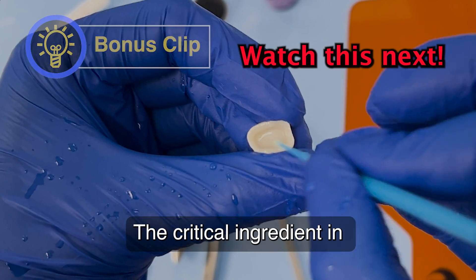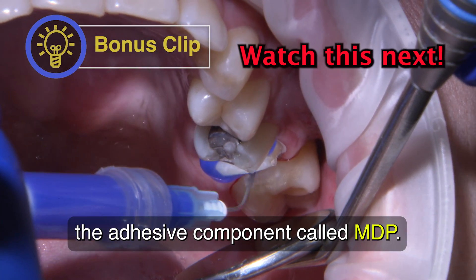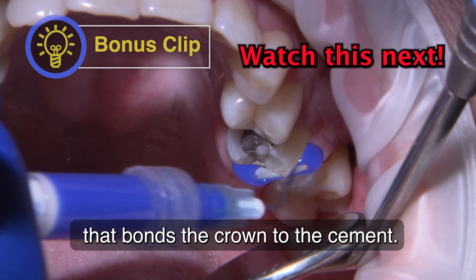The critical ingredient in bonding zirconia is the adhesive component called MDP. This is the chemical coupling agent that bonds the crown to the cement.